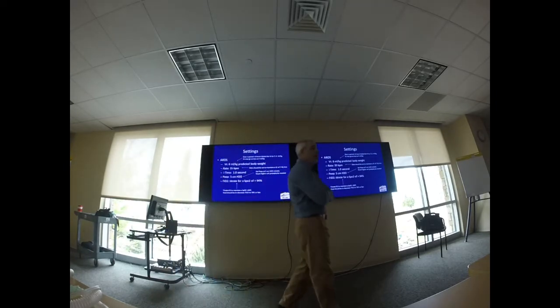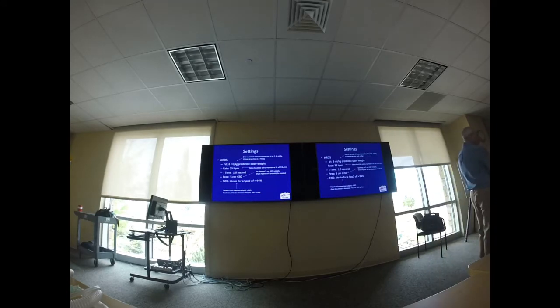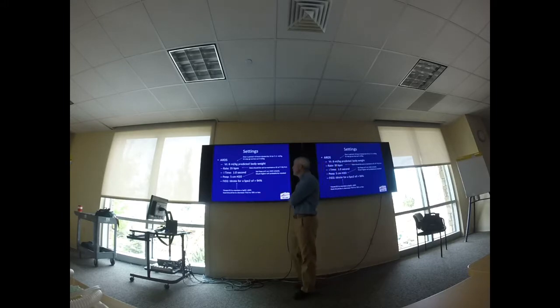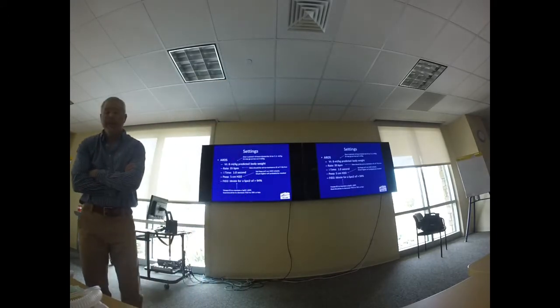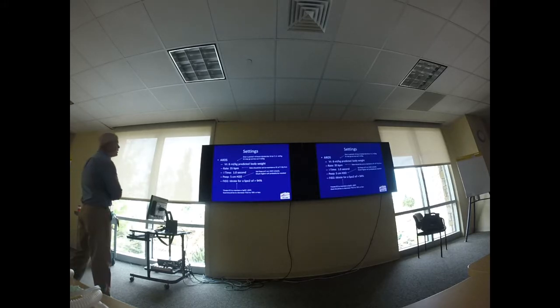And so again, I think the thing to know is that most often your patients are going to be normal settings, 6 to 8 cc's per kilogram, I time of 1. Rate 10 to 16 to titrate with an end-tidal CO2, titrate your FiO2 for a pulse ox greater than 94. But the ARDS one is the one that we get paid for, right? So this is the one that you're gonna really work your butt off. So, how do you guys want to do this?